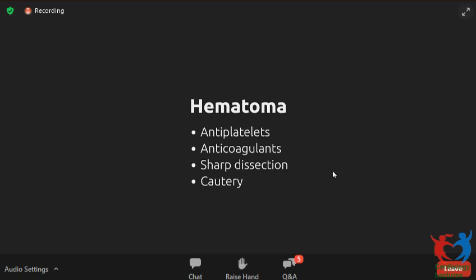For leads left in situ during a pulse generator change due to lead parameter abnormality, is long-term anticoagulation required? No. Like we discussed, for any leads on the right side, you don't need anticoagulation. I think what you're asking is about a patient with a dual chamber device who has ventricular lead malfunction, and you put in a new ventricular lead while the old lead is left in situ. Your patient will end up with 3 leads, but all the leads are still in the right ventricle. We don't give them anticoagulation or antiplatelets.